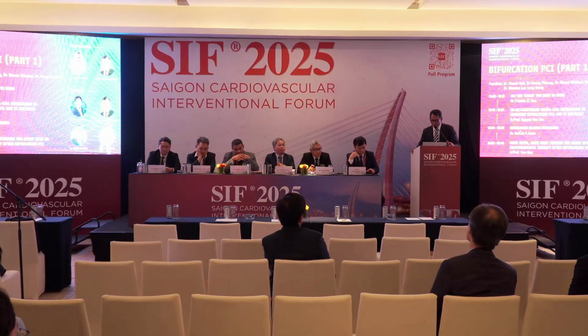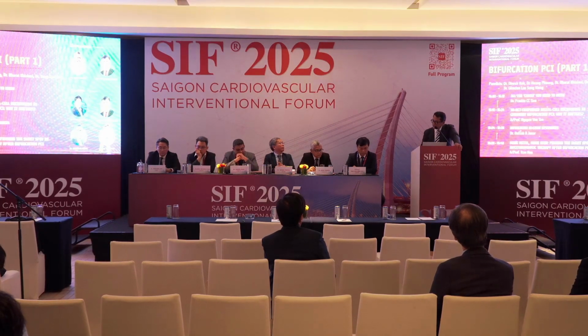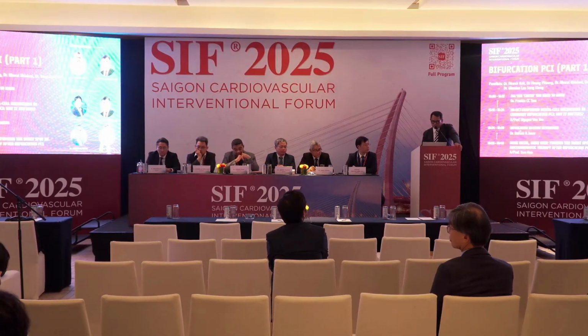I think in this case IVUS would help, because IVUS would show the adventitia and the external elastic lamina, and depending on how big a chunk you have within the external elastic lamina, then I would undersize the balloon.